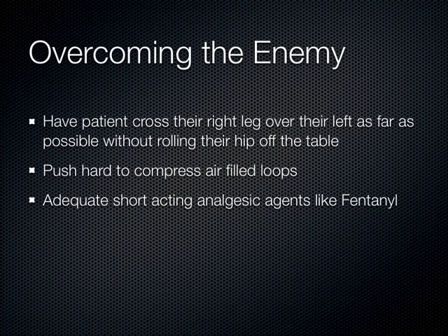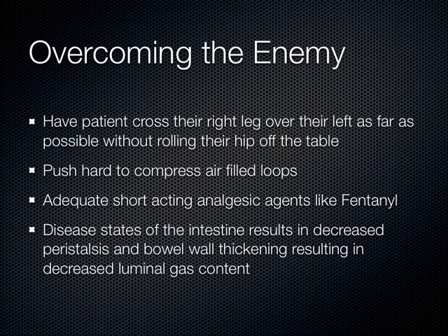So I go in the room with the nurse and say, okay, you push the fentanyl, I'll start the ultrasound, because it starts working almost immediately when you push it. And then you'll see, sometimes you have to use two hands to do this compression. And again, I keep coming back to this. When you have a disease state, that reduces the amount of peristalsis, there's more bowel wall thickening, and there's less intraluminal gas, and all of this makes it easier to visualize the intestinal contents.